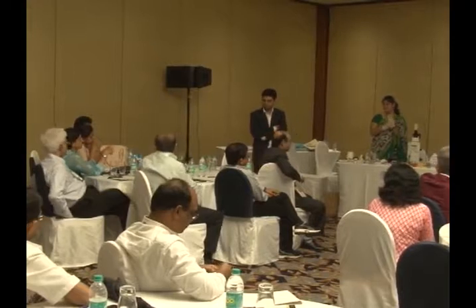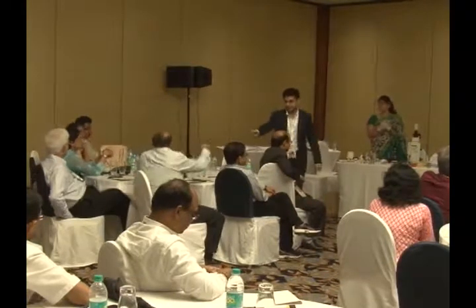But most of the time we are not informed that we are going to get the sample, so how can we prepare the media? Directly you get the sample. Then you have to keep a criterion for your lab that we will not process such samples, and make the gynecologist understand that this is the procedure which has to be followed. So you should inform us at least 2 hours prior before getting the sample. And we cannot keep it in the fridge. It is better to get the information at least 1 day prior, or maybe a few hours before. That is the only way out.